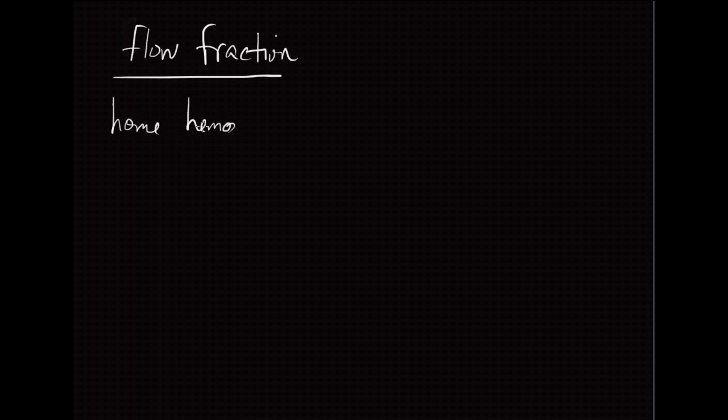What we said in the prior lesson was that there are certain parameters we fix as physicians, we dictate, and there is another parameter that is dependent on all of the parameters that we dictate. What we want is a Kt/V, so we tell our machine the Kt/V we want. We tell the machine what the blood flow is going to be, based on the patient's comorbid conditions. And we tell the machine what the dialysate flow rate is going to be, because we have a limited amount of dialysate to use as a result of limited space in a patient's home.